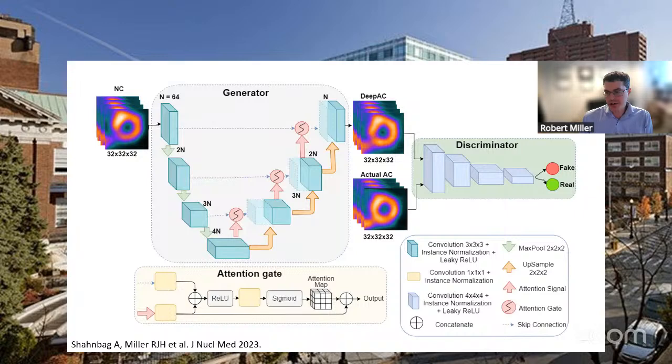Another major issue in nuclear cardiology is attenuation defects. So this is actually the bane of most of the cardiology fellows that rotate through the nuclear cardiology elective, is trying to decide what's real and what's fake. One way to address this is CT can be used to correct for these attenuation deficits. Most scanners used in the US and Canada are actually not hybrid systems, so CT-based attenuation is not available. This is another task that maybe deep learning could be doing for us.